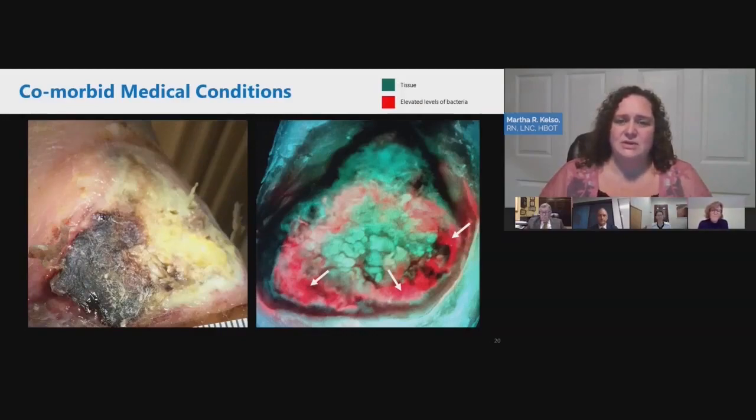And so this is one of those wounds that doesn't really meet the clinical signs and symptoms of infection. And yet, when we used MolecuLight or bacterial fluorescence, look at that red glow. So it changed the outcome in the treatment. Instead of continuing with dressing changes, the advanced wound clinician decided to sharp debride, try to get that unhealthy tissue out of the wound and clear the bacteria from the wound.